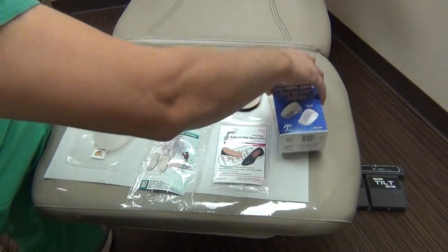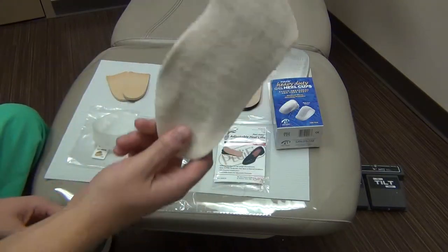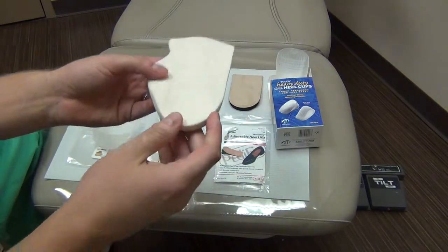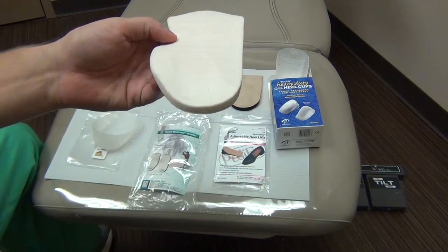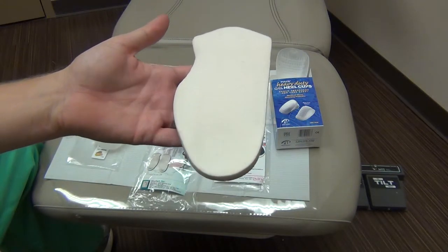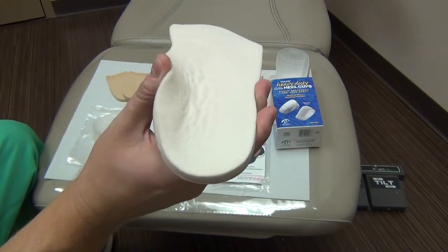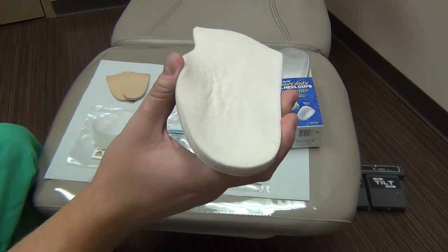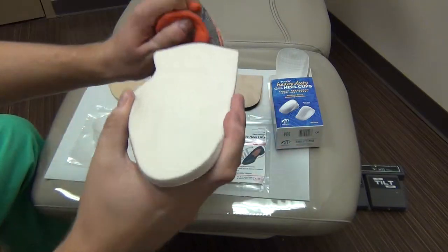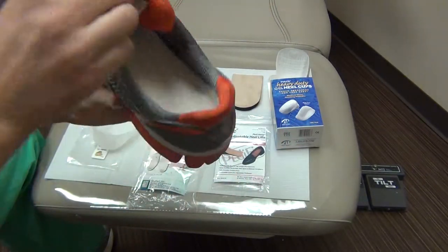The other options we have available for just generalized heel pain are these heel pads. Heel pads have a little indentation in the heel to allow for comfort for patients suffering from heel pain from heel spurs or plantar fasciitis. There's a nice little arch that kind of slides up — when you put it in a shoe, it actually rolls up on the inside to give them more arch support.